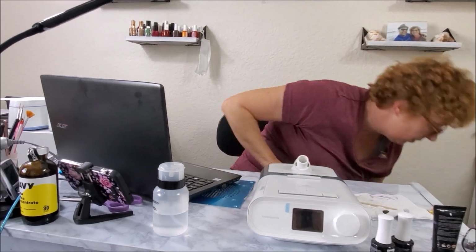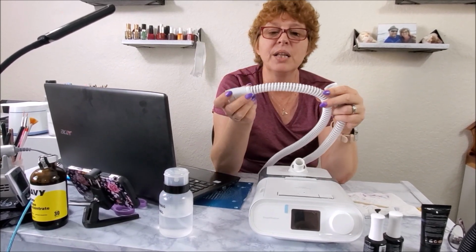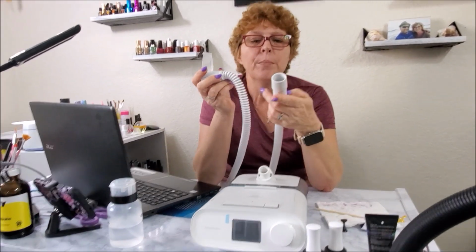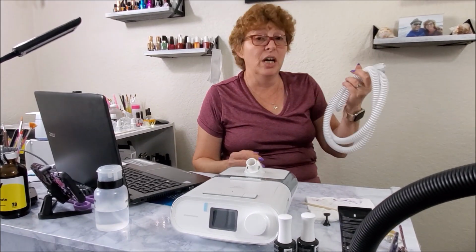So there's a lot going on here, but I can tell you right now, you better make a machine that I can use my SoClean on, because I want my machine clean. This is why people buy that machine, because this stuff is plastic. That's rubber. This is plastic. Plastic that heats up. Bacteria gets in here, and not just plain soap and water is going to do the trick. I don't care how, I mean, if it's really super hot, yeah, I've done mine super, super hot.